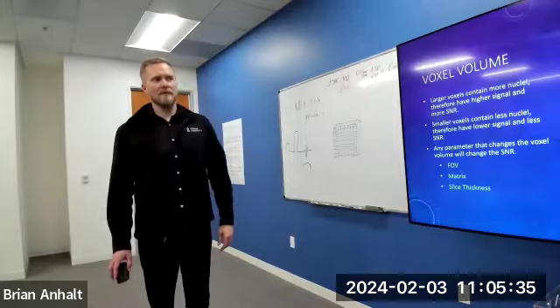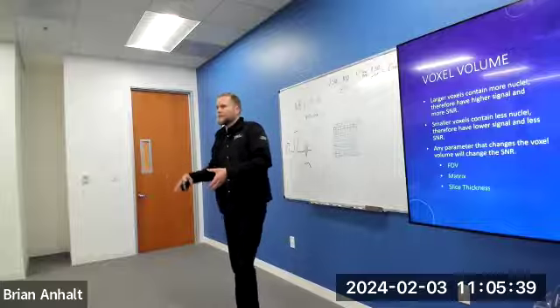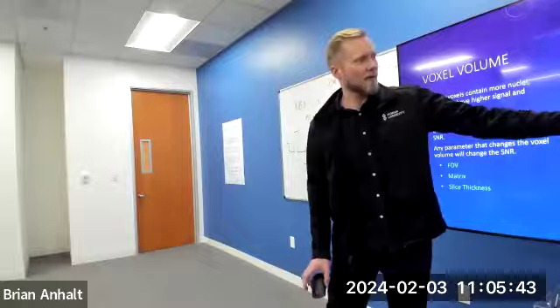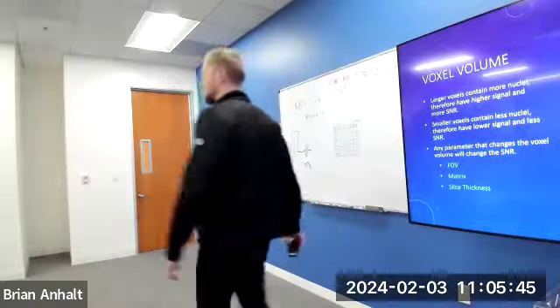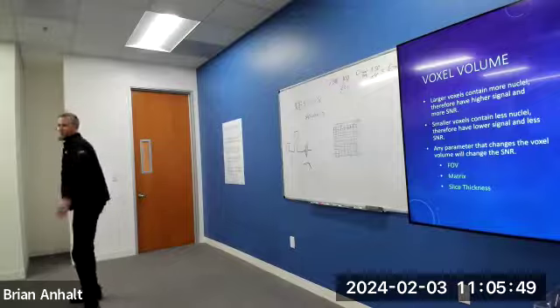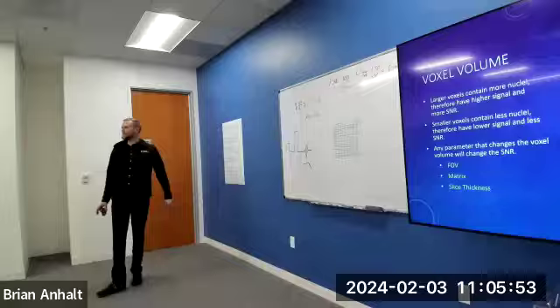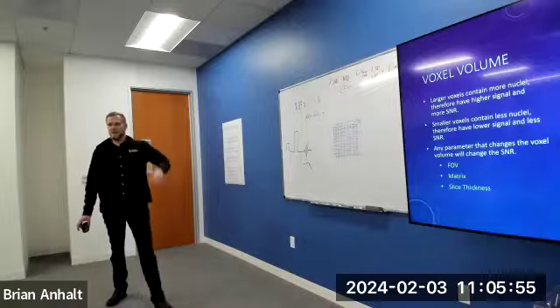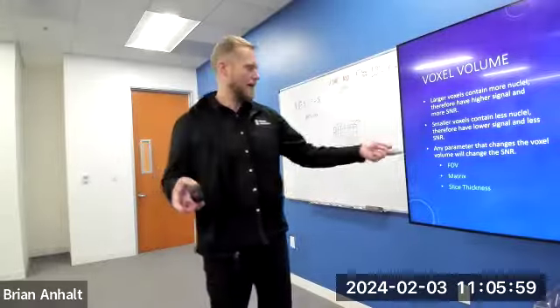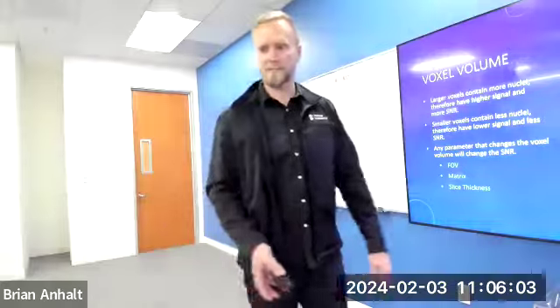The reason voxel volume is important in SNR is because the larger the voxel, the more protons it can hold. If it can hold more protons, what do you think happens to the SNR? It increases. The bigger the pizza slice I have, the more stuff's there, more stuff to eat. So in MRI, if I have larger voxels in my image, I'm going to have better SNR, just because there's more protons there.